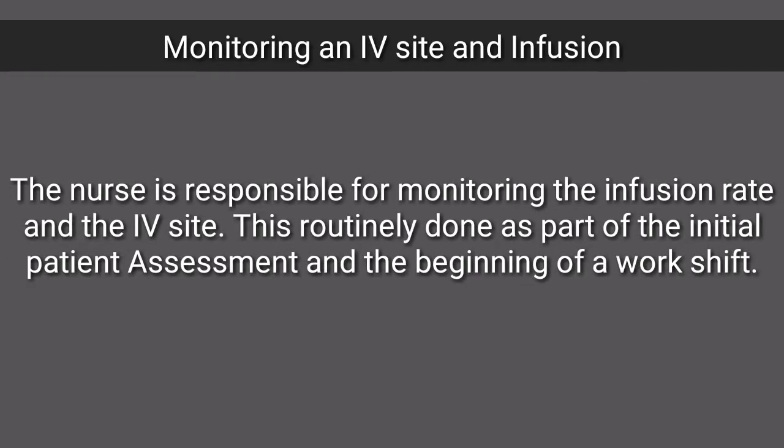Monitoring an IV site infusion. The nurse is responsible for monitoring the infusion rate and the IV site. They are routinely done as part of the initial patient assessment and the beginning of a work shift.